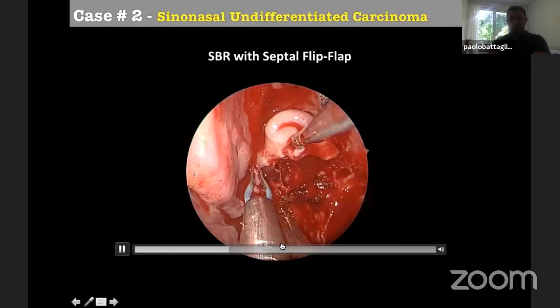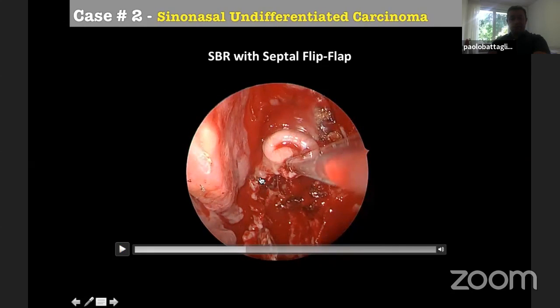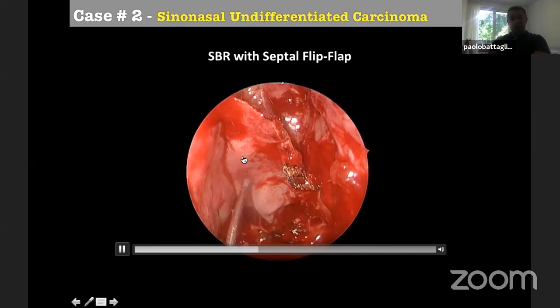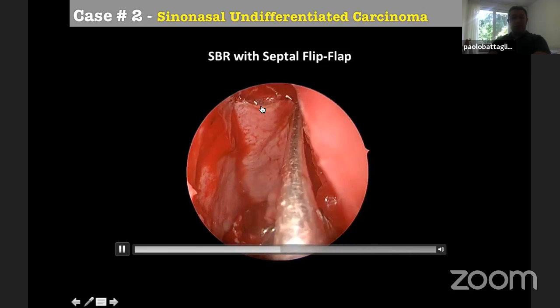The length, you can modulate the length. Then we coagulate the septal branches of the sphenopalatine artery over here. Remember, if you do not, you will have postoperative bleeding when you perform the posterior incision at the level of the anterior wall of the sphenoid. And you can see, you can flip the flap up.